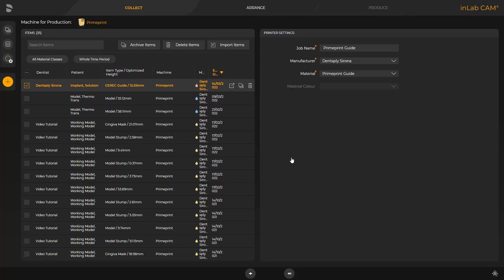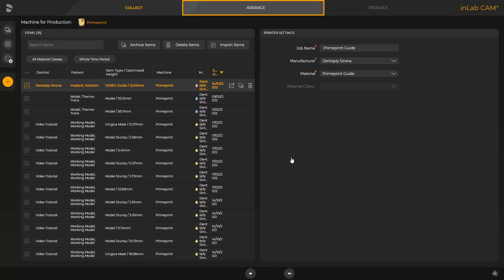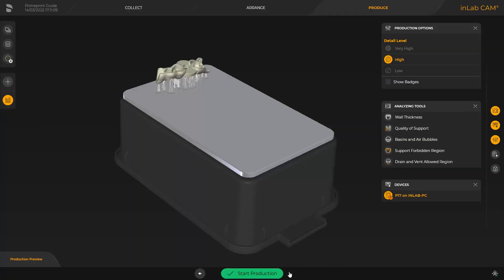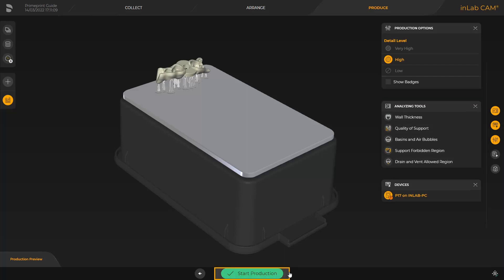After the InLabCam software is opened, all cases previously transmitted are displayed and the CEREC guide job is already selected. Here, we can either select the so-called FastTrack by tapping the double arrow, or we can switch to the next phase, the Arrange phase. FastTrack will take you directly to the last phase, Produce. In this case, the InLabCam software automatically positions and orients the print object on the build platform, and also defines the support structure automatically. Detailed information about the InLabCam software can be found in a different video tutorial. We click on the double arrow and can finally modify the detail level in the window under Production options and analyze the print object with the analyzing tools. To start printing, we tap the green area labeled Start Production.